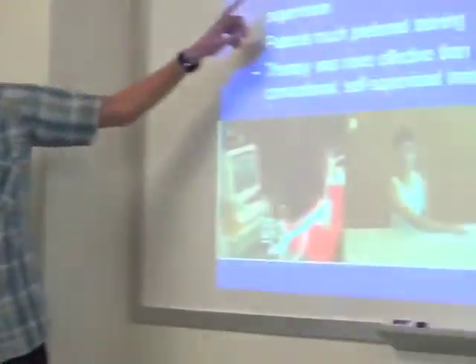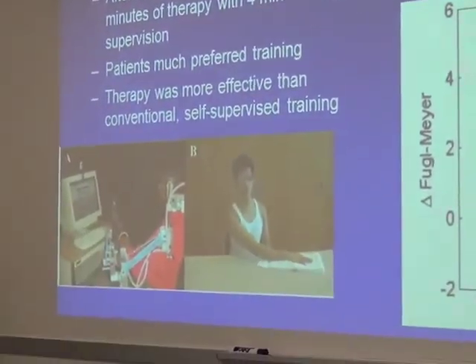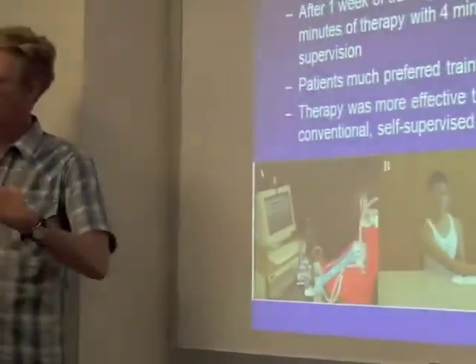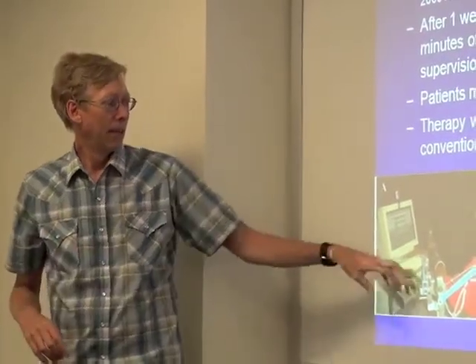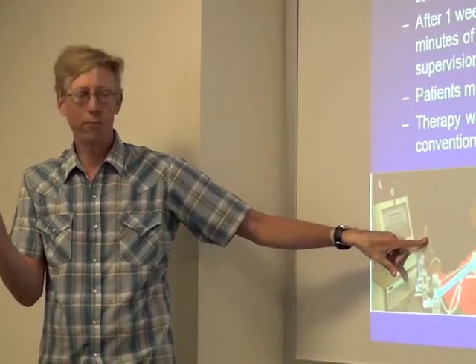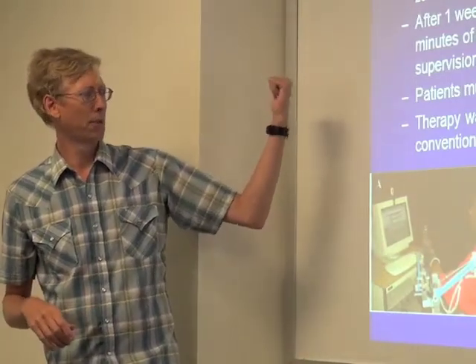Okay, and then a device that we developed here is called T-Rex. We took a mobile arm support developed by Tariq Rahman at the Nemours Alfred I. duPont Institute for Children in Delaware. It was for kids to put on their wheelchair so they could help feed themselves. It relieves gravity using rubber bands. We scaled it up, put sensors on it, put on a hand grip that could measure really small amounts of grip force, and then developed a series of computer games. You can see it afterwards. It's in the room over here.